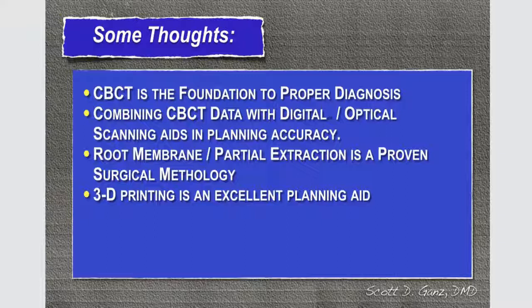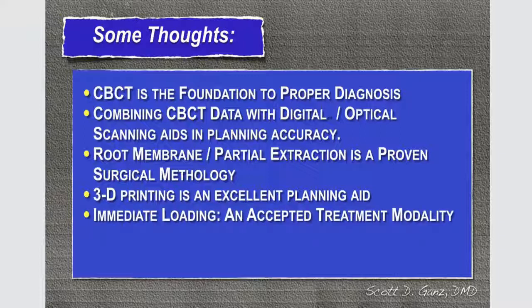So we're using 3D printing. Not only is it an excellent tool for creating our surgical guides, but it's an excellent planning aid because we can print a mandible or a maxilla in advance of the procedure, and we're able to hold the mandible or maxilla in our hand, especially when we're doing sinus augmentation procedures or other more complicated procedures, like as you've seen with the chrome guide and stackable guides. We really always will print a 3D model of whichever arch we're working on.